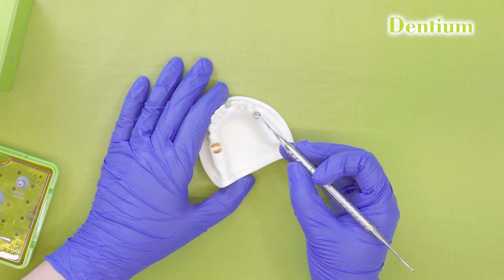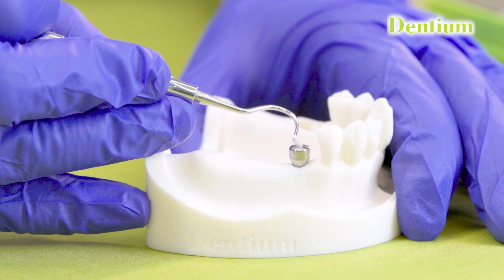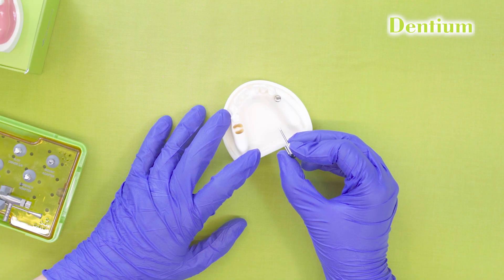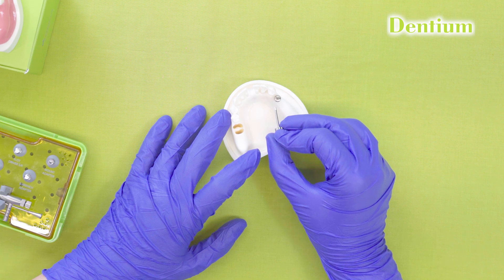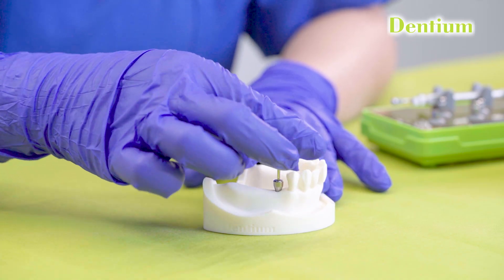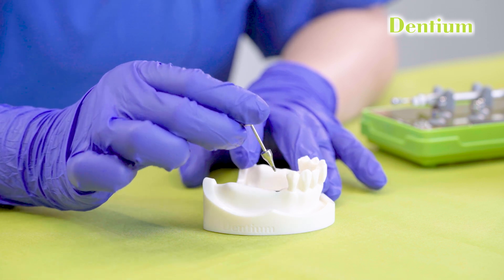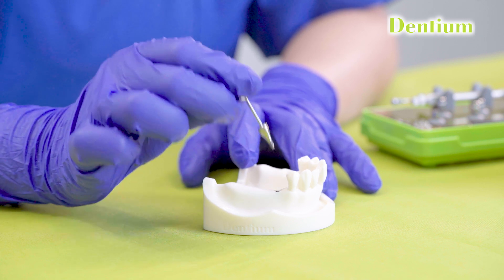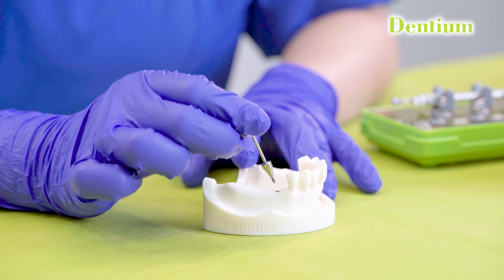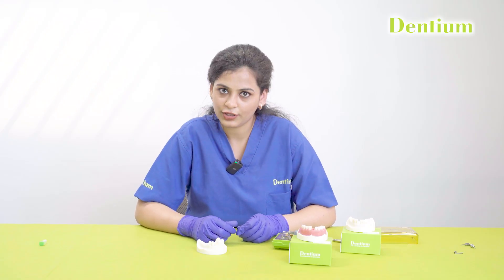In the patient, inspect the healing abutment carefully and make sure any food debris is removed from the hex slot. Once the food debris is completely removed, the hex driver is seated over the healing abutment and removed in an anti-clockwise direction. The hex driver provides a friction fit interface which prevents slippage of the healing abutment while tightening or removing it in the patient's mouth. If the component is slipping, it can be due to debris in the slot or the component being old and worn out.